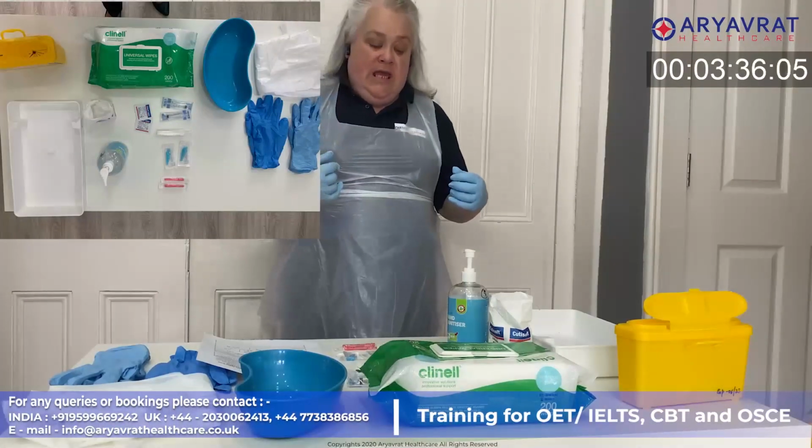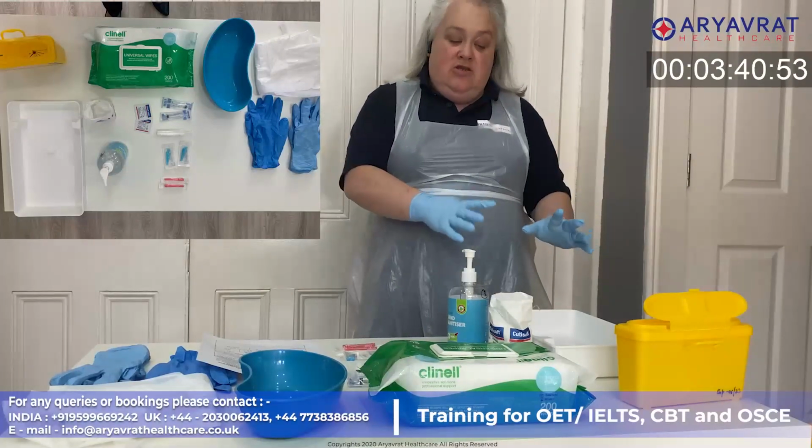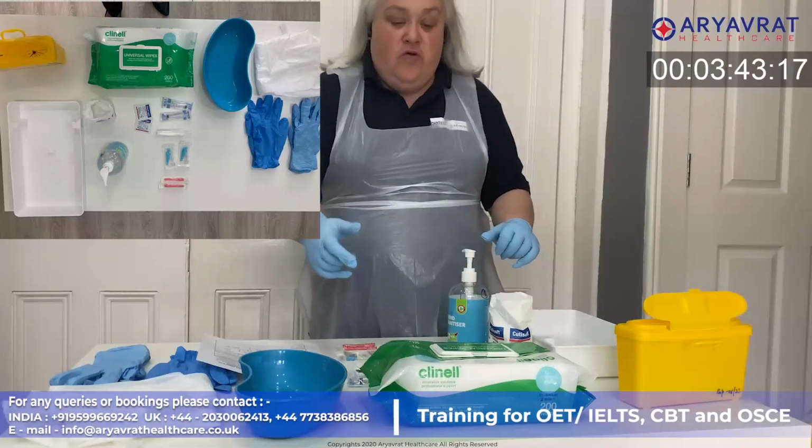Okay, so I have on a clean pair of gloves and apron, and I'm going to clean the tray that I'm going to use for the injection.